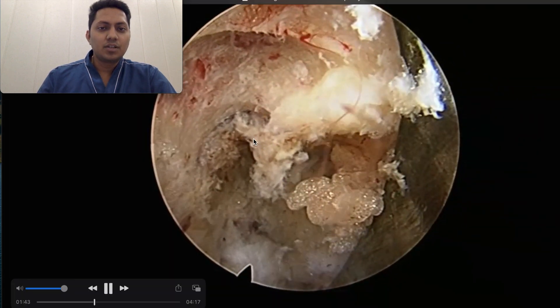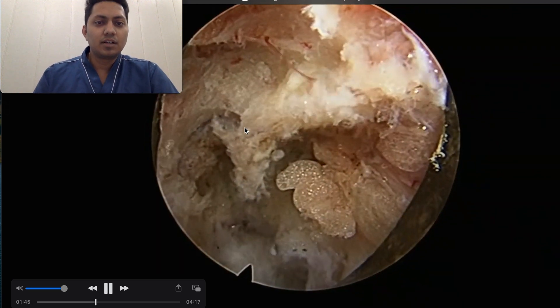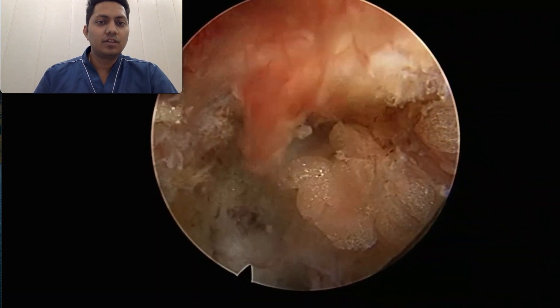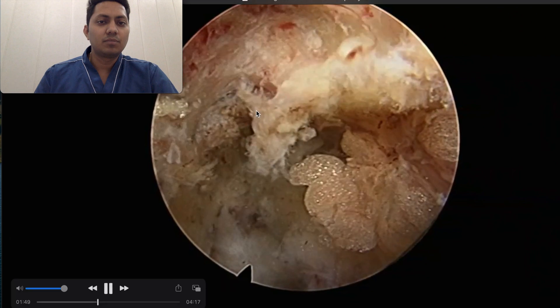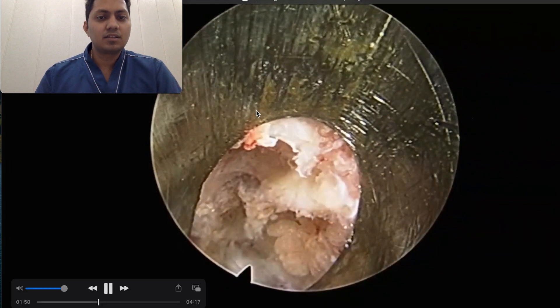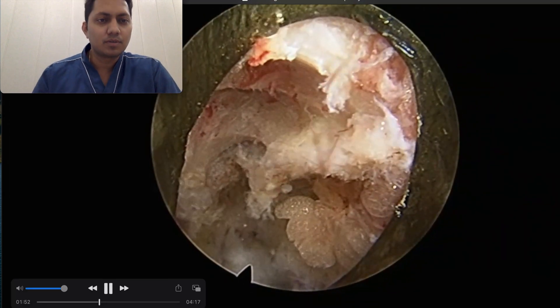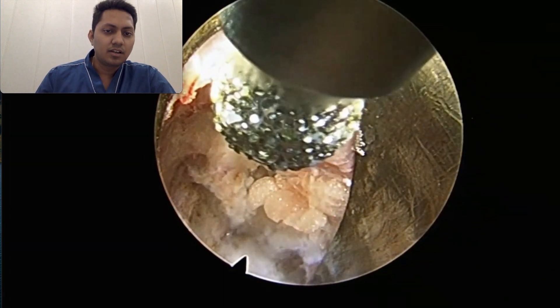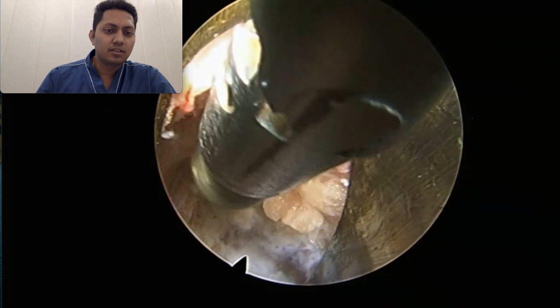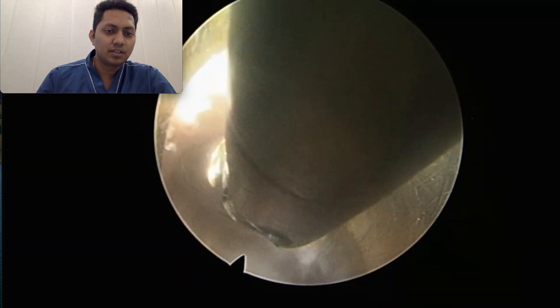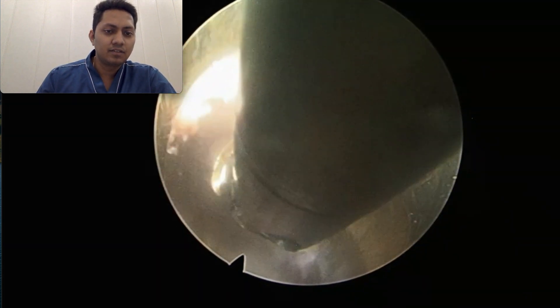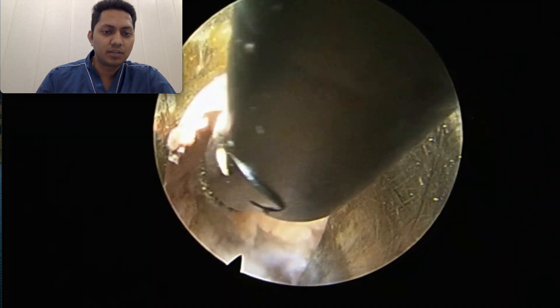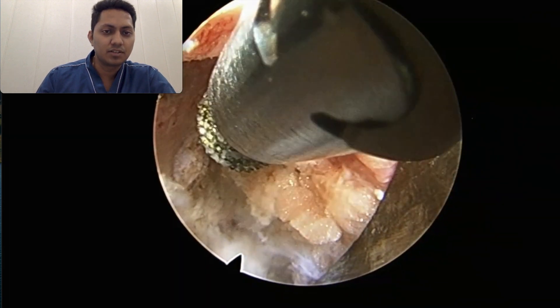I am using a diamond burr here because it helps reduce the bleeding encountered from the bone — the dust it creates blocks those bleeders, and it is known to cause less bleeding compared to other kinds of burrs. Diamond burrs are my recommendation here.